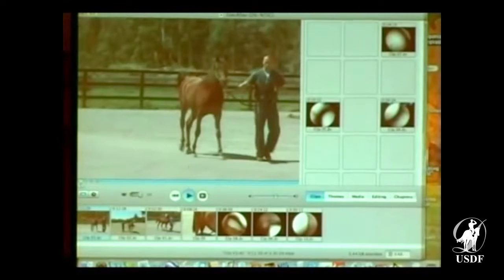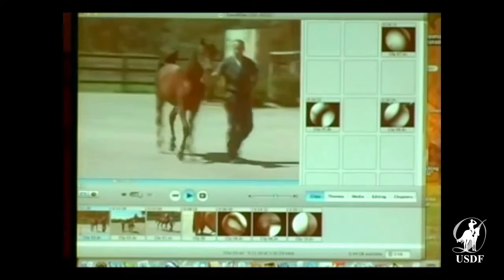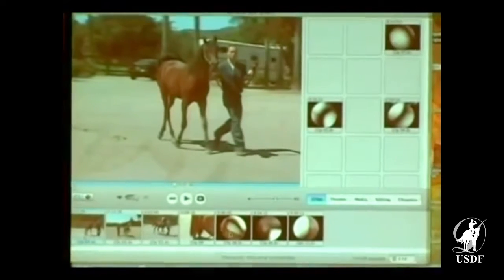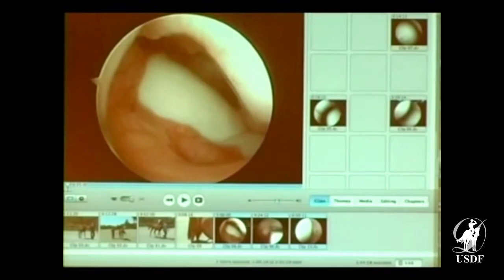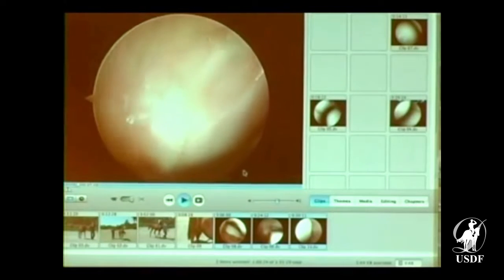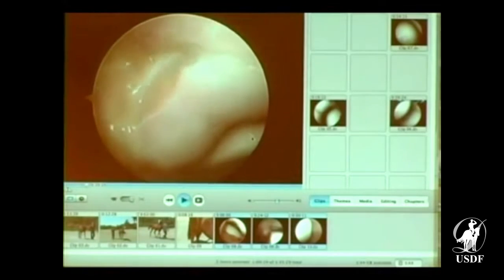It'll come up here. Okay. So here he is, very lame in the right stifle, lots of swelling. And we tried a whole bunch of treatments before surgery that didn't work. But now we're putting CO2 in there. And so these are the joint surfaces with CO2, no fluid in there. So we put the scope right in there.